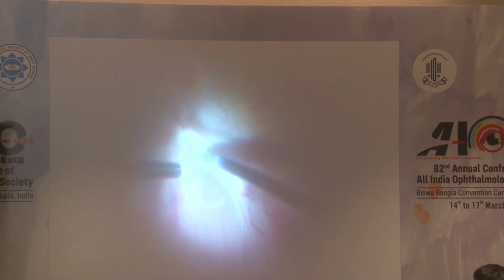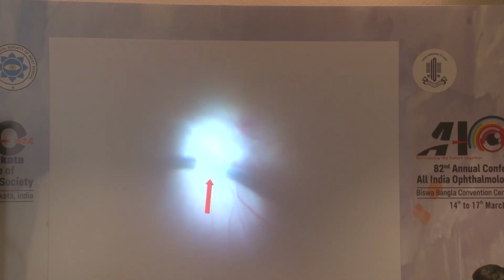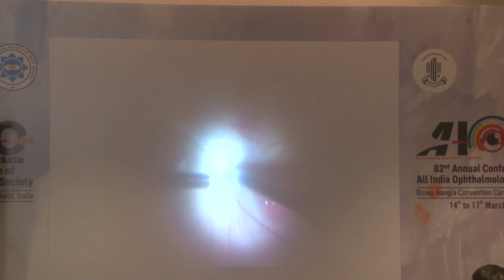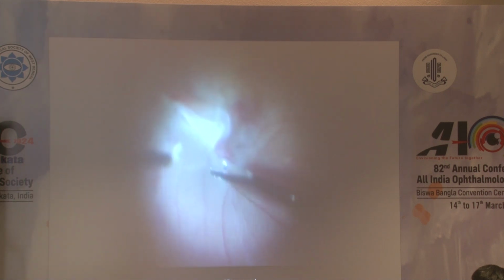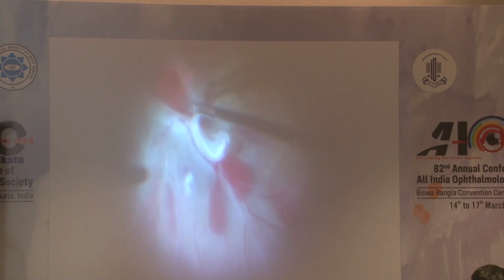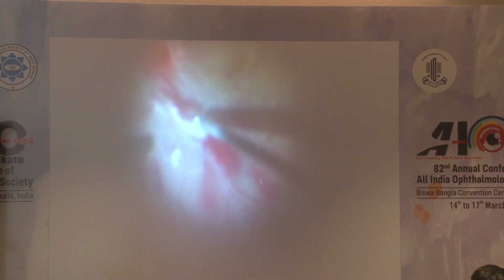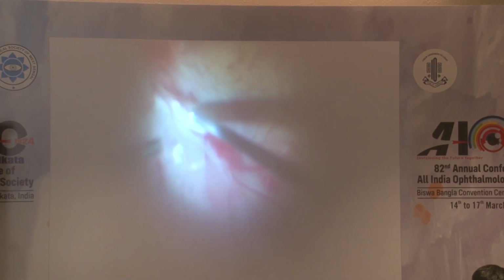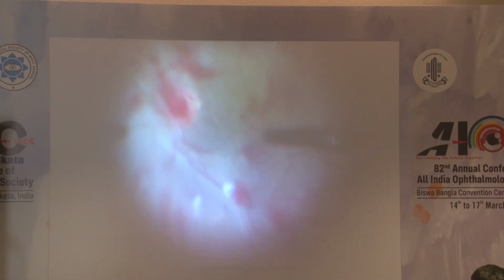Here this is a small island which is left. No actual good plane can be found in this area. What we can see is now the arrow points towards a shining membrane, which is the second membrane and which cannot be peeled off, or our vitrector cannot get into a good plane by which we can remove this. So what we do next is we use an ILM forceps, and you can see the release of this membrane, and after peeling of this membrane we have now secured a good plane and this island has now been cut with the vitrector. Now you can see that the epicenter is gone, but there are bleeders.